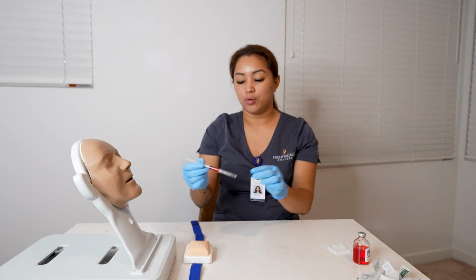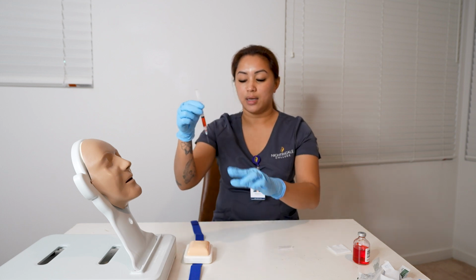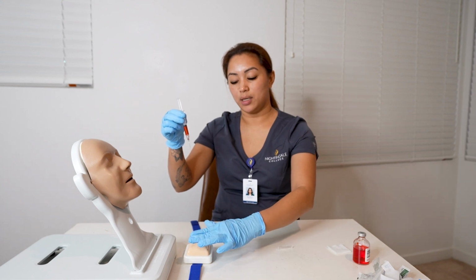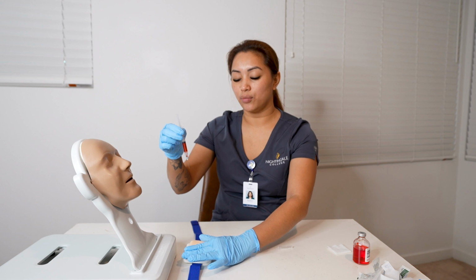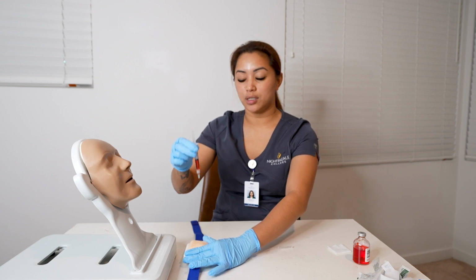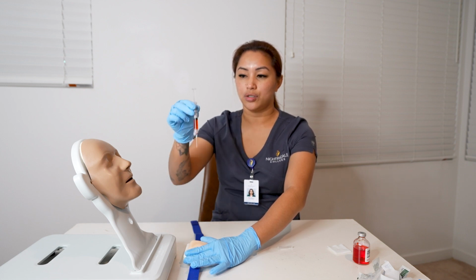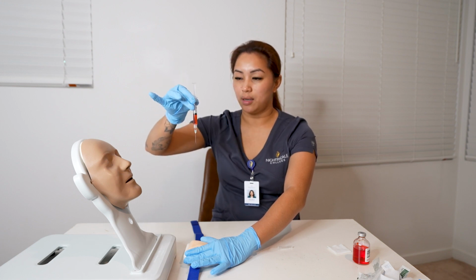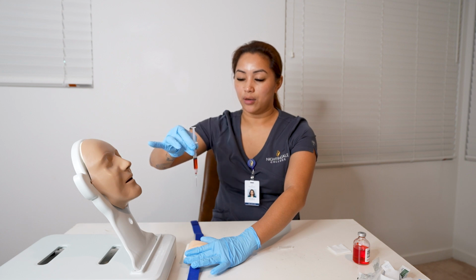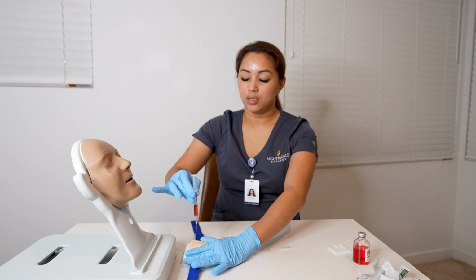Alrighty, so now I am going to uncap the medication. And now I am going to spread with my non-dominant hand, spread it tightly without touching the injection site. With my 2 fingers, all right, and then just straight down like a dart. My palm is down and my thumb and my finger is holding it like a dart. All right, perfect. 1, 2, 3, Miss Smith.